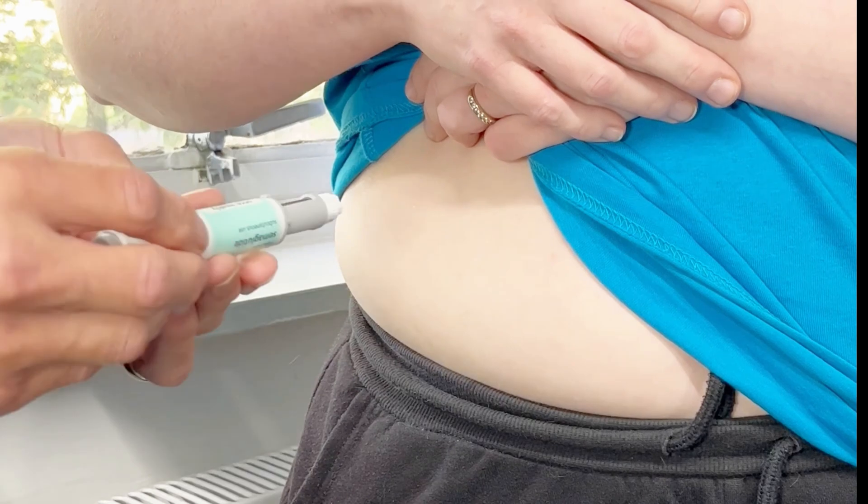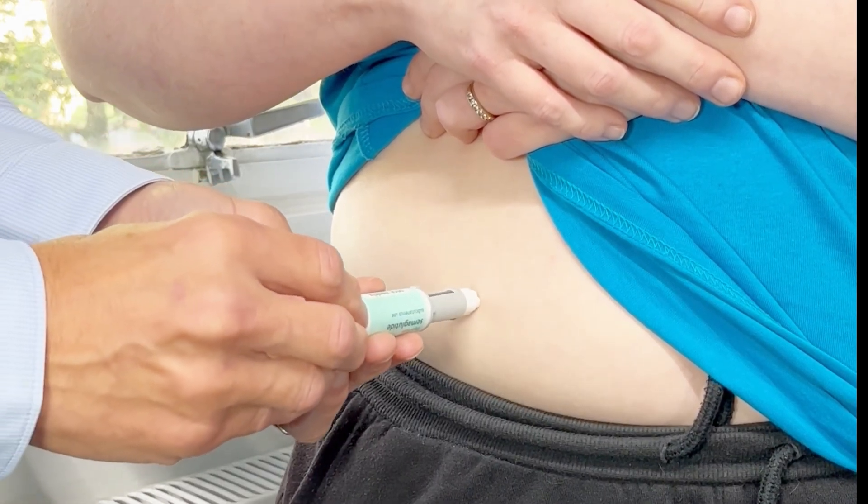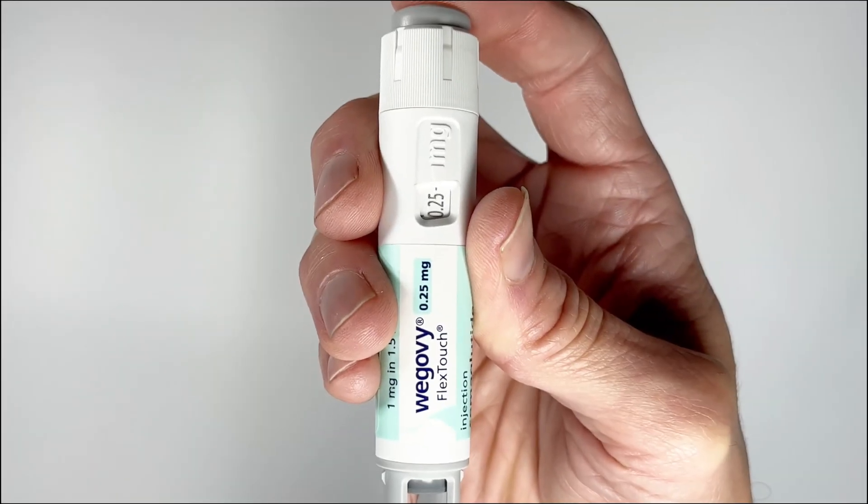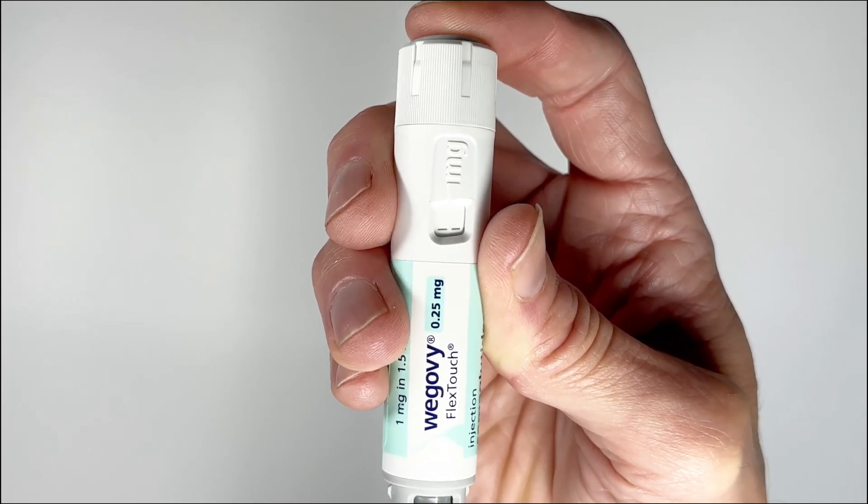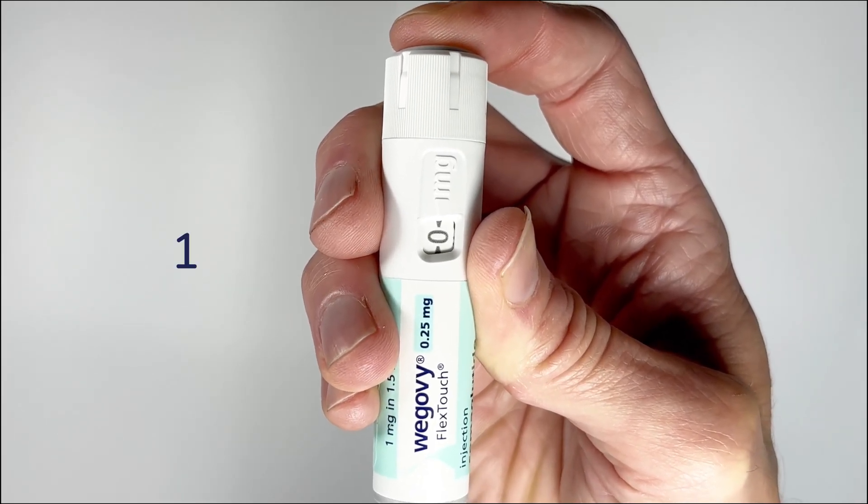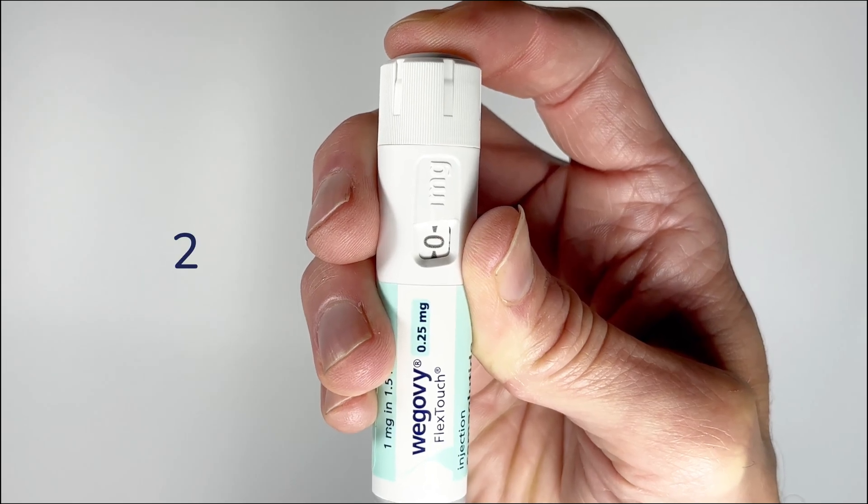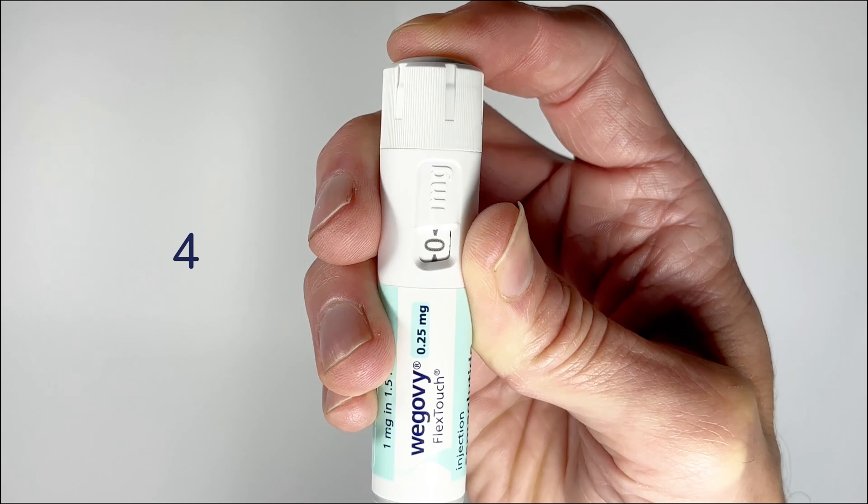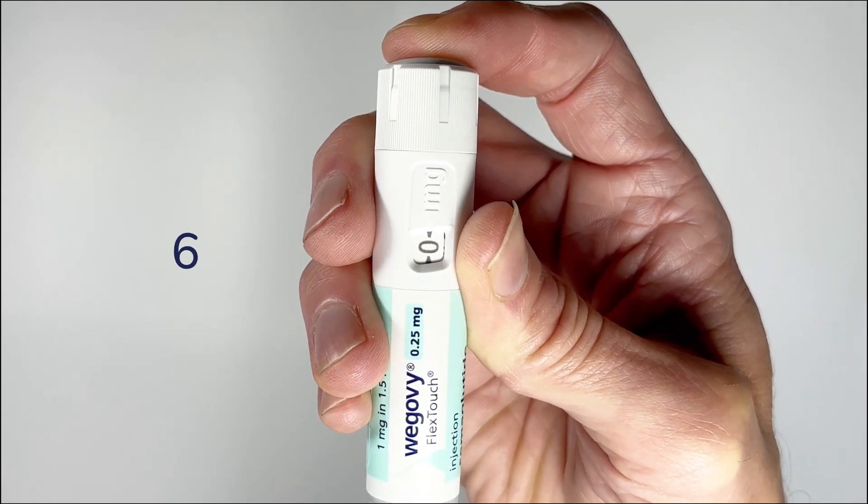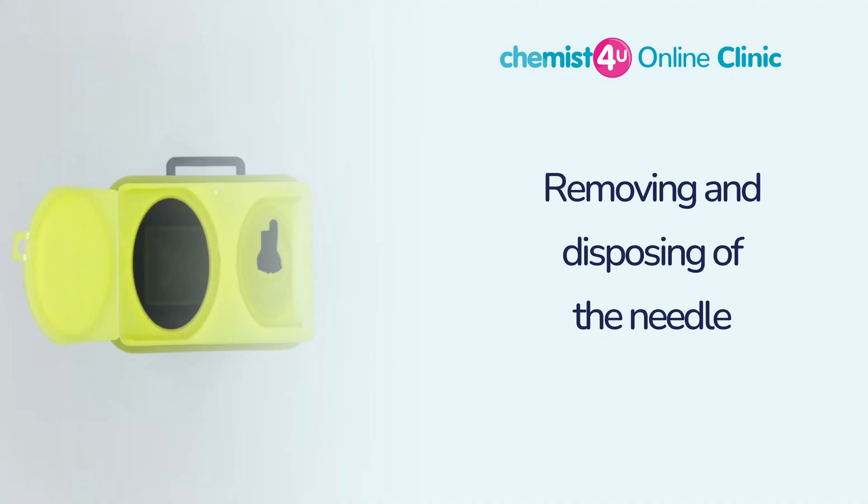When you are ready to inject, insert the needle into the skin. Make sure you can see the dose counter. Press and hold the dose button until the dose selector says zero and you hear a click. Continue to hold the dose button in and count to six to make sure the dose is fully delivered. Then carefully remove the needle from the skin and prepare to dispose of the needle.